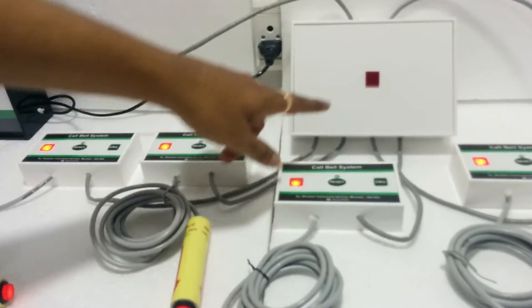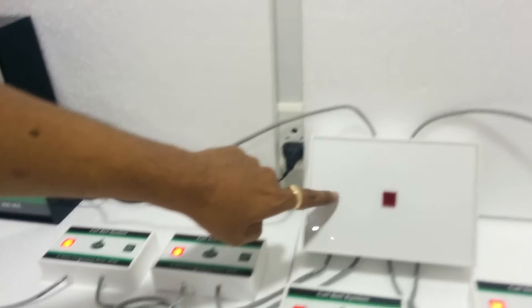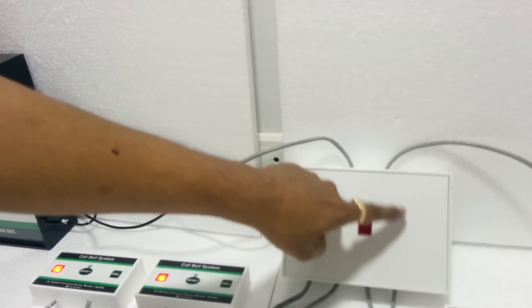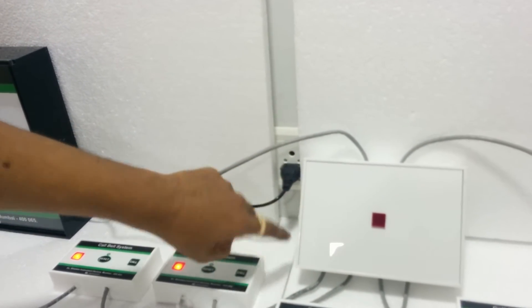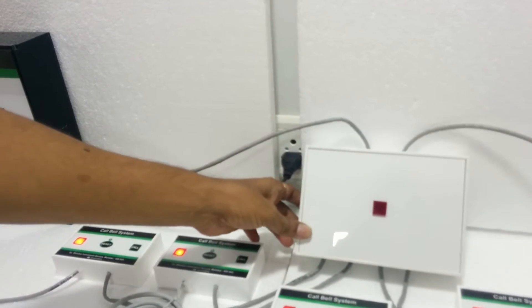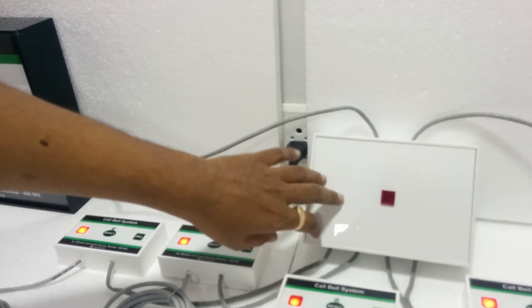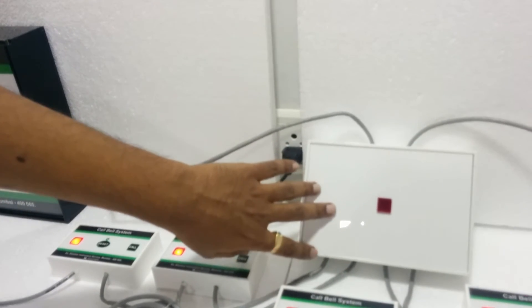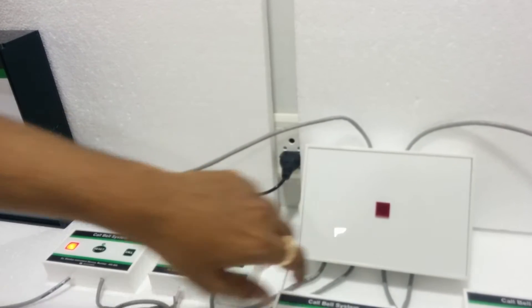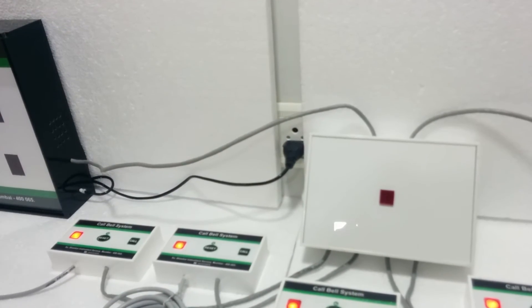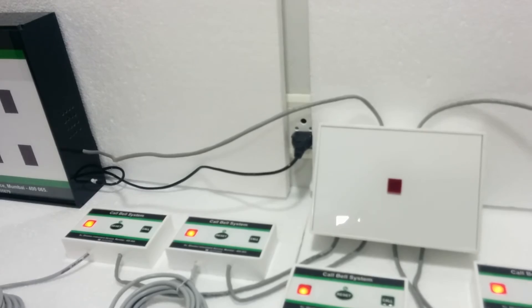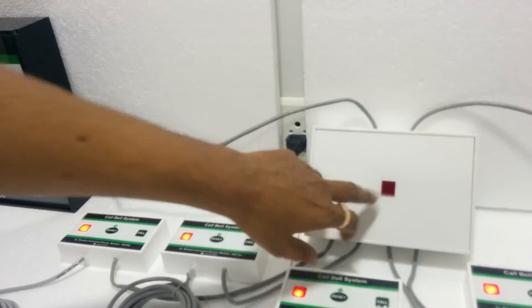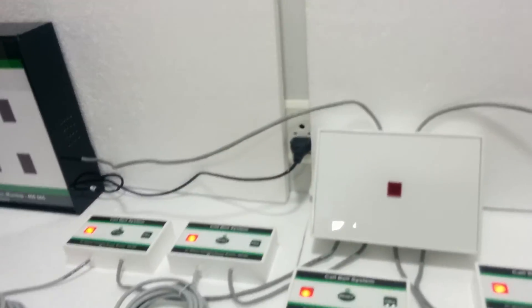This is called a ward attendance light, located outside the gate. When any patient calls for the nurse, this light glows outside the ward.